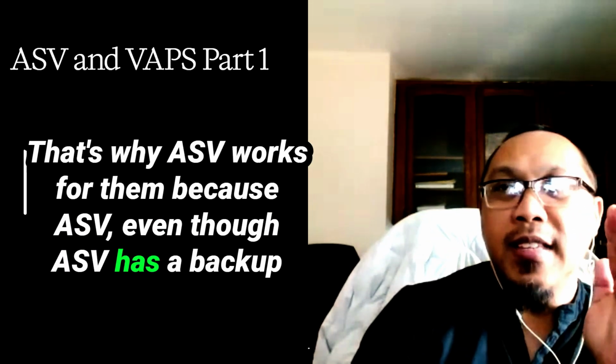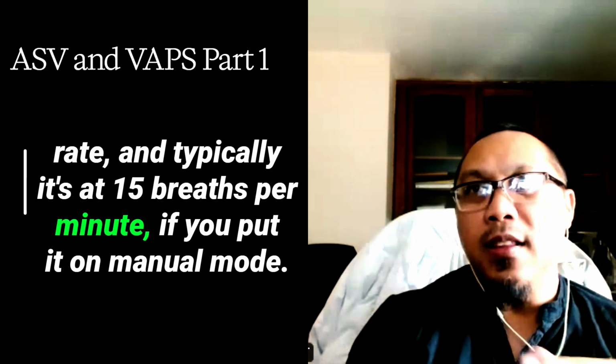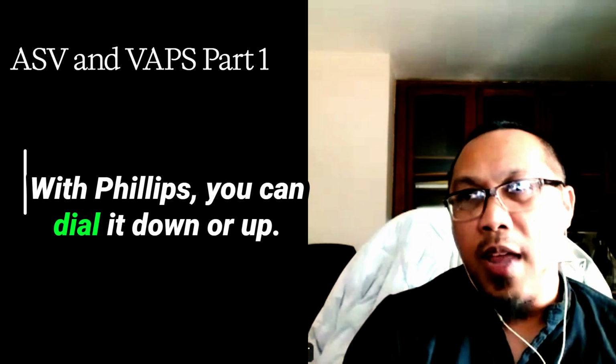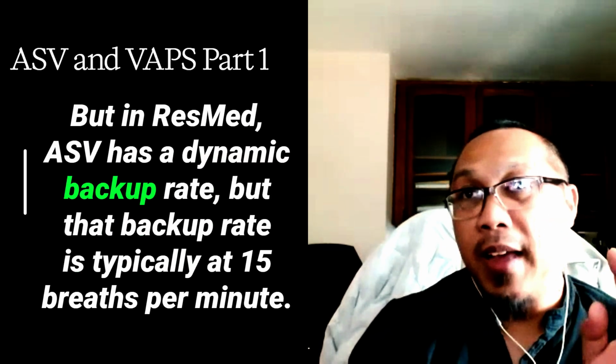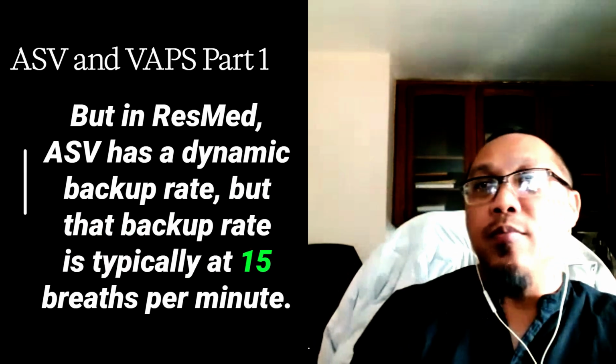That's why ASV works for them, because ASV has a backup rate, and typically it's at 15 breaths per minute. If you put it on manual mode with Philips, you can dial it down or up. You can increase or decrease that backup rate. But in ResMed, ASV has a dynamic backup rate. But that backup rate is typically at 15 breaths per minute.